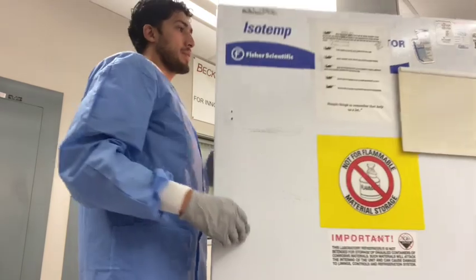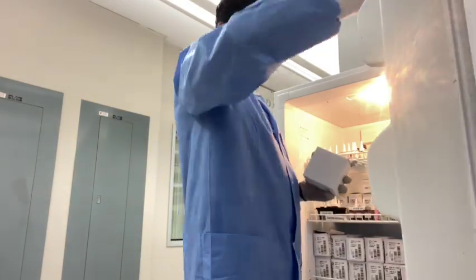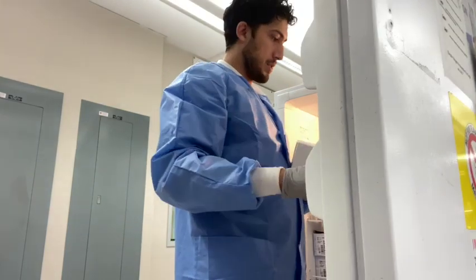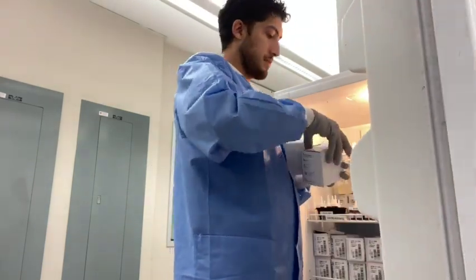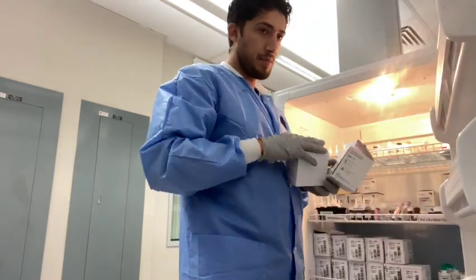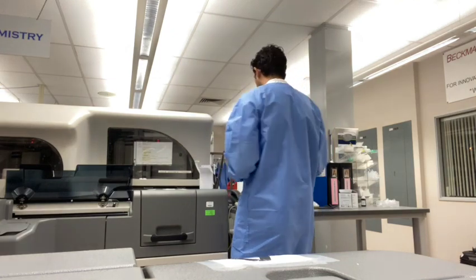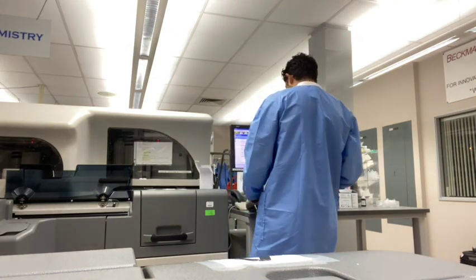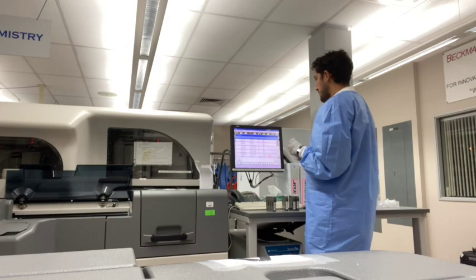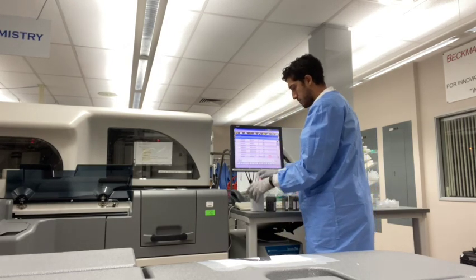So typically I begin my shift doing quality control and maintenance on the machines. Here I am grabbing the calibrator required so that I can go ahead and get started on this process. Here I'm setting up my calibrator so I can go ahead and load it into the machine and begin calibration.